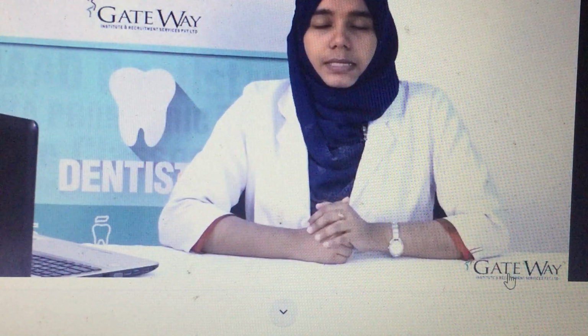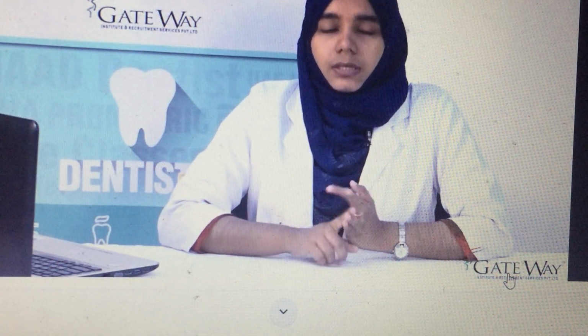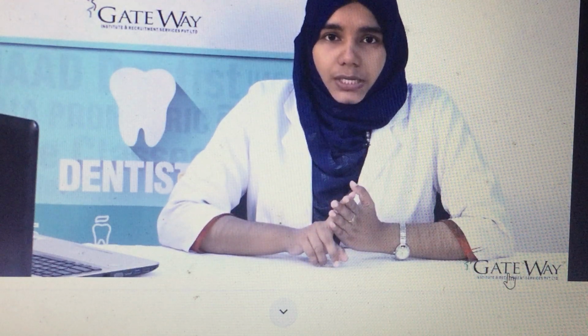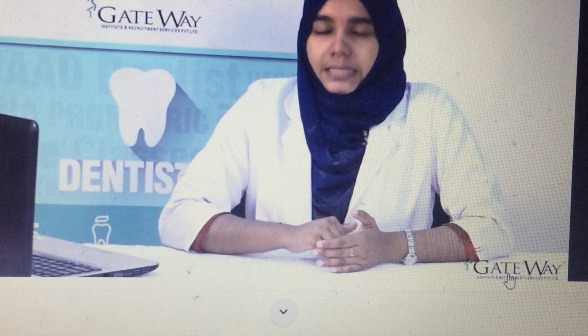So first principle, that is accessibility. Second one, visibility, illumination, retraction. Third one, maintaining a clean field. Fourth one, condition and sharpness of instrument. And fifth one, that is instrument stabilization. Here, instrument stabilization you have to study in detail.